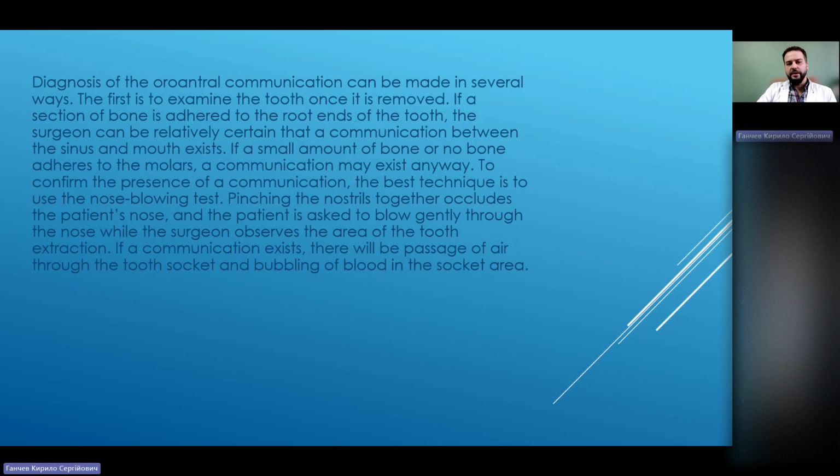If a section of bone is adhered to the root ends of the tooth, the surgeon can be relatively certain that a communication between the sinus and mouth exists. That's a huge problem, as I said. If a small amount of bone or no bone adheres to the molars, a communication may exist anyway. To confirm the presence of a communication, the best technique is to use the nose blowing test. It's very simple to do, actually. You pinch the nostrils together, yeah, like this.